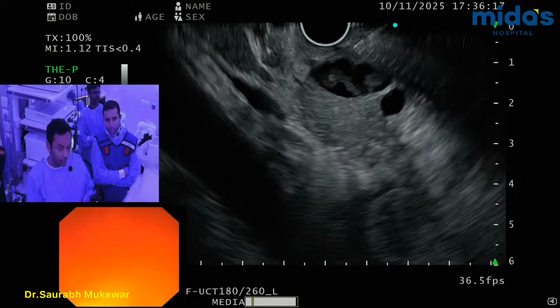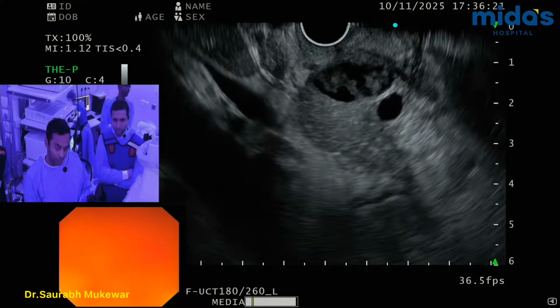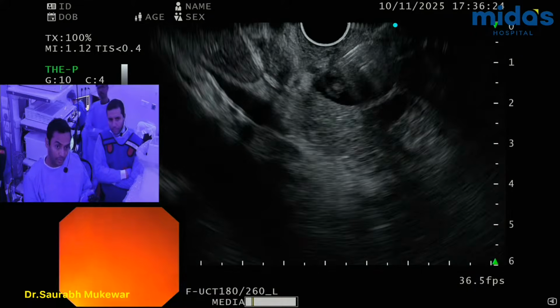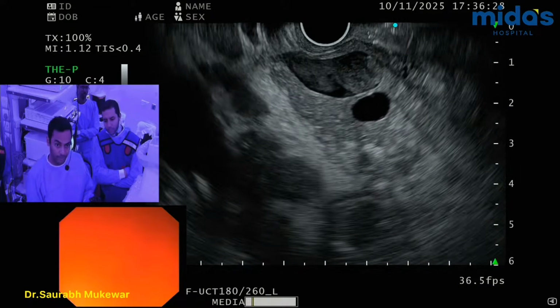And the other point is that you have to have a stable position, because if you are not in a stable position, then it's another problem. So you got to be in a stable position. I'm getting the needle hub out till, let's say, 2. This looks good here. Okay.